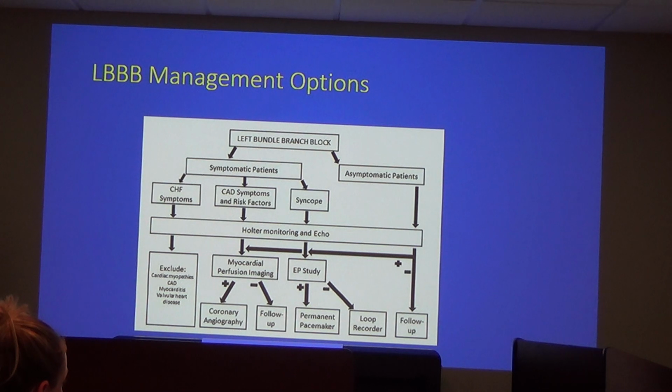So this is just a framework to think about it. Basically, the point of this slide is to say a left bundle branch block usually means there's something going on. Use your usual thought process and figure out what that thing is.